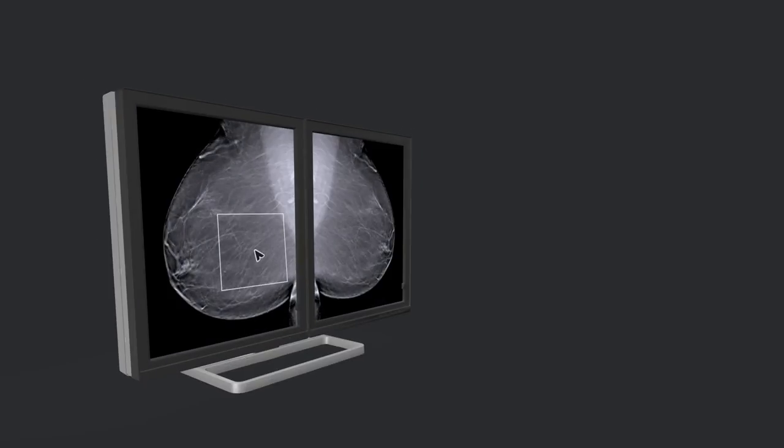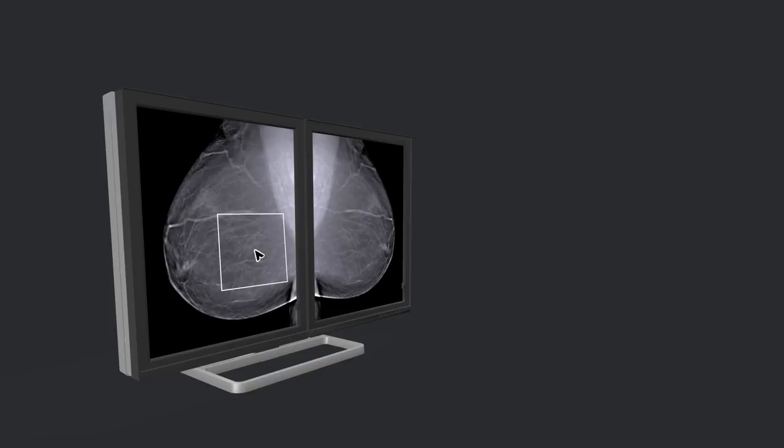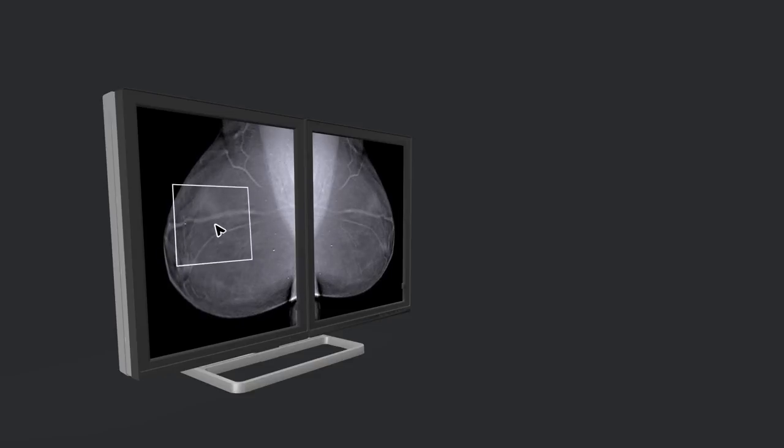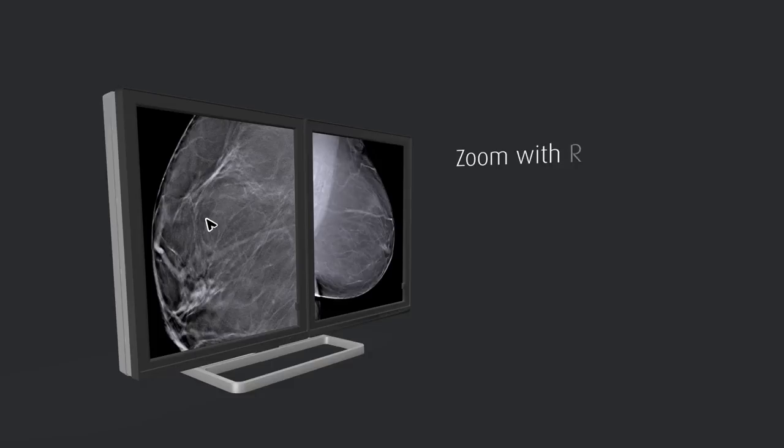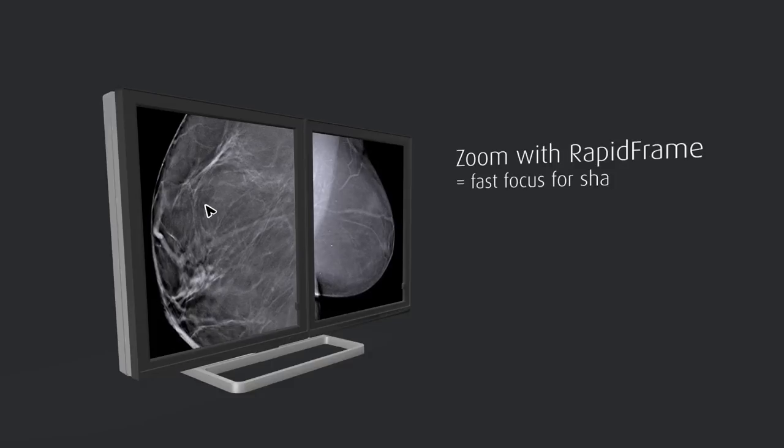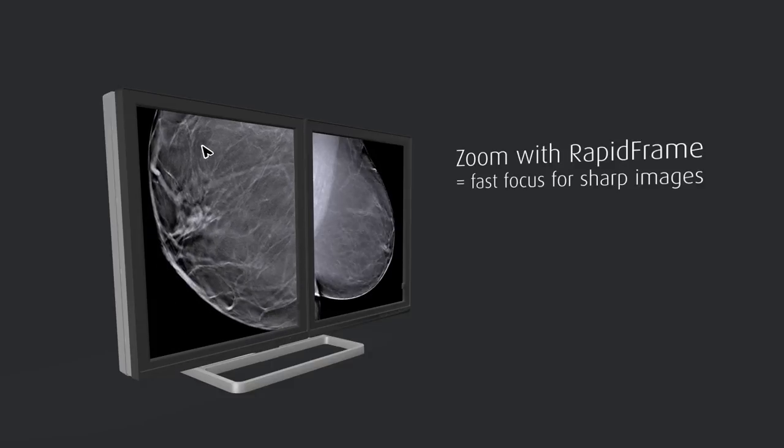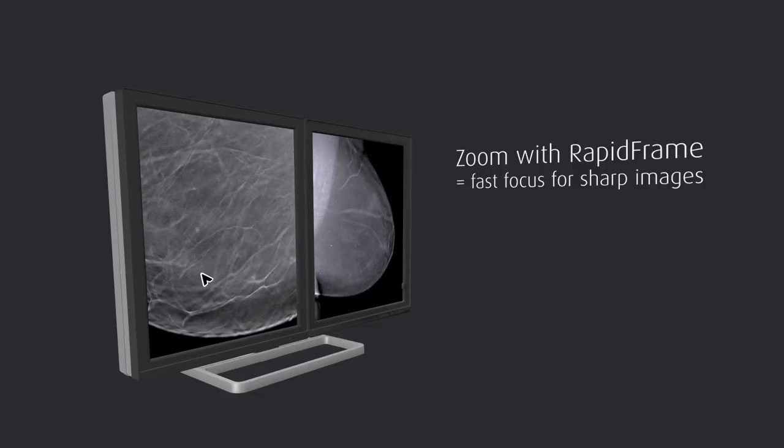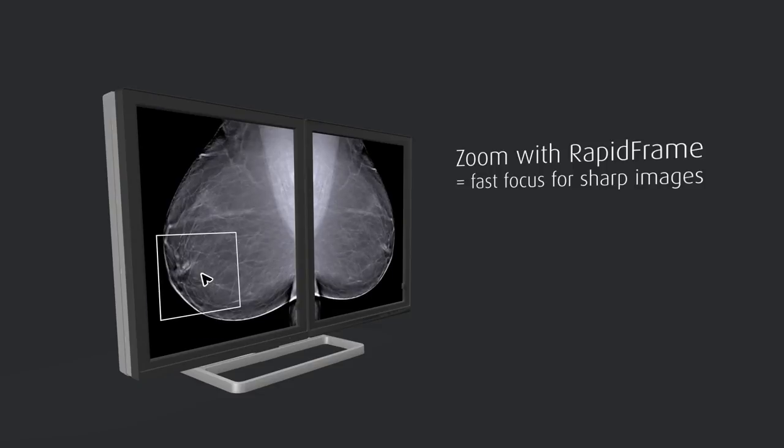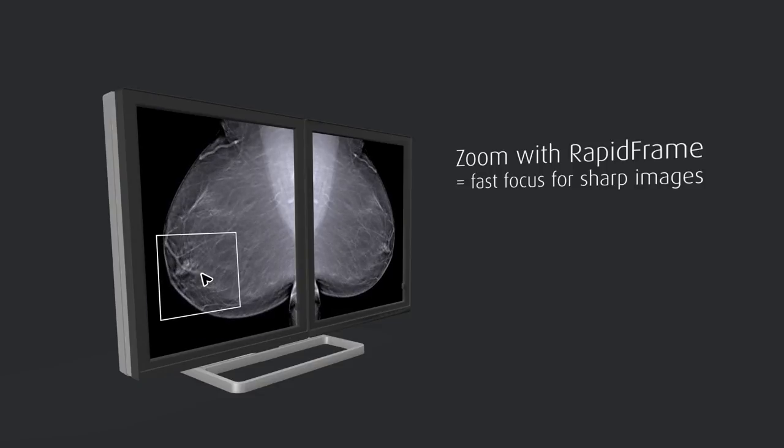This also means that when using tools like the zoom tool or the magnifying glass, even on 2D images, the image is sharp immediately. The radiologist doesn't have to stop and wait for the image to come into focus, as is the case with traditional displays.